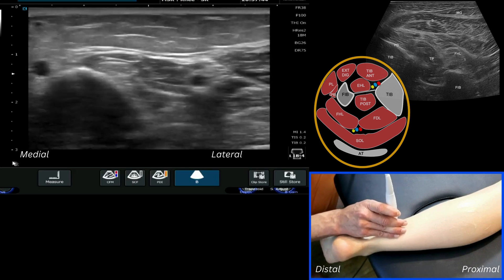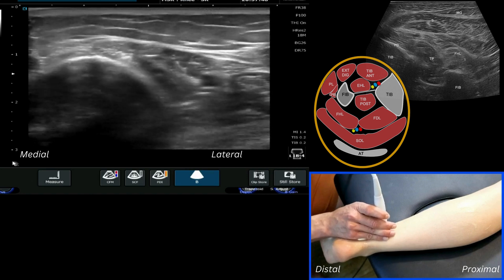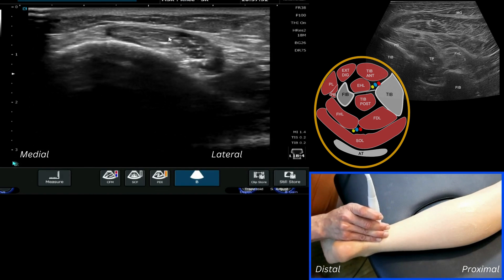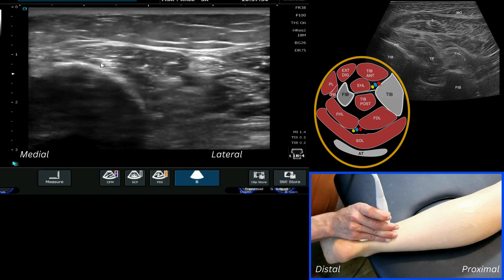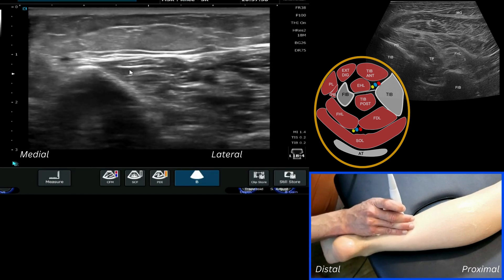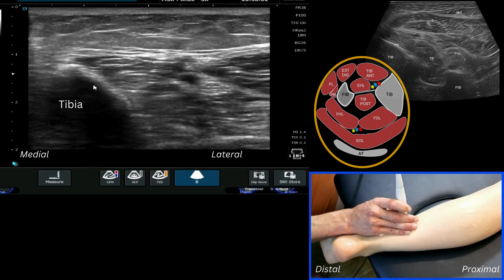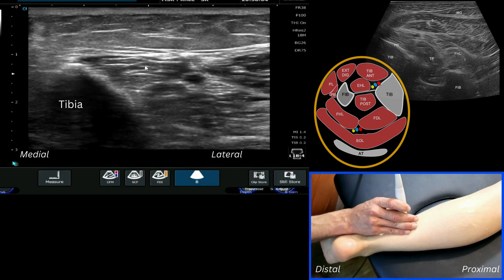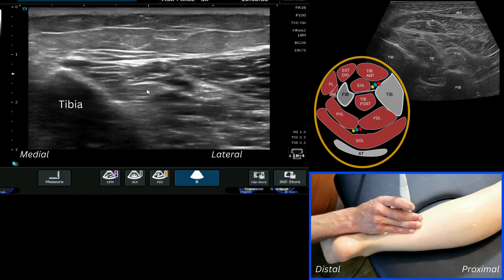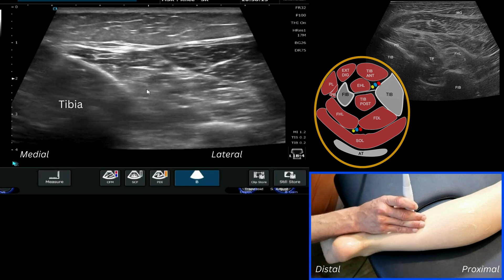What's of interest is that using the cursor here, you'll note that the flexor digitorum actually starts to move over the top of tibialis posterior and come around heading further across onto the tibial shaft. So this is the tibia here, we've got the flexor digitorum that has moved across, and this is the remaining tibialis posterior tendon here.